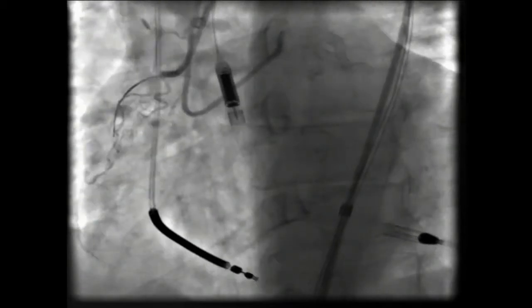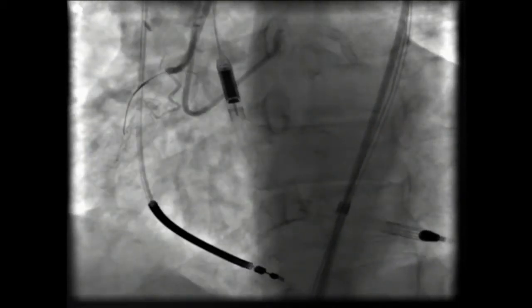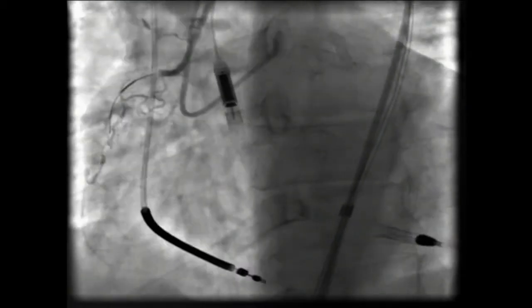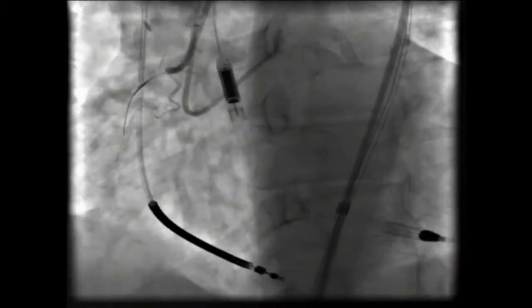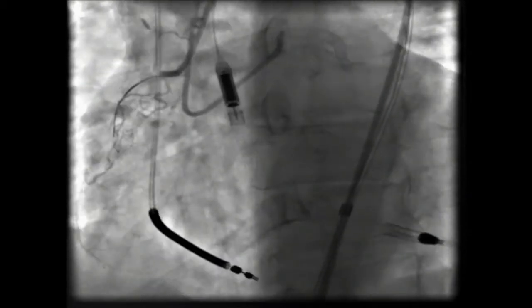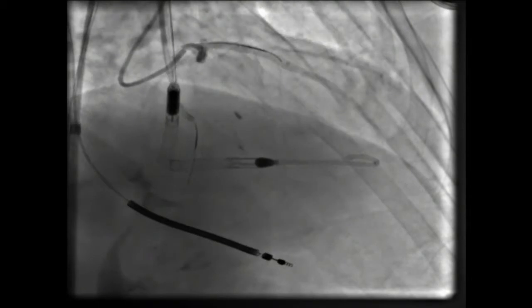intubated. And so they brought him back and said, hey, we'll fix the LAD first, which they did before I came in, but they already had the Impella in. And then we decided this time to primarily try a retrograde approach, make a little bit of antegrade progress. And I'll just go through this kind of briefly.